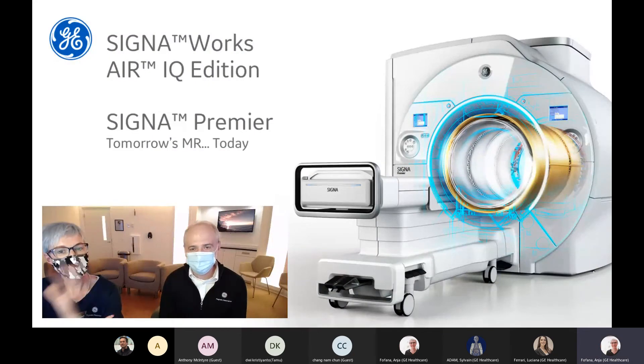Hi everyone. My name is Steve Lawson. My name is Anya Fofana. Welcome to our live sessions for ISMRM scanning session. Today we'll be highlighting the latest software release with SIGNAWorks AIR IQ Edition while we scan on the SIGNA Premier, highlighting musculoskeletal and orthopedic imaging with OrthoWorks.